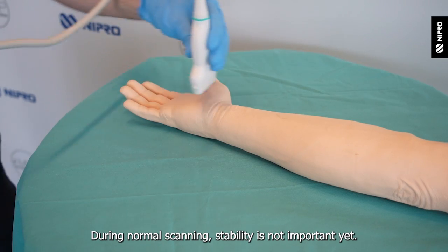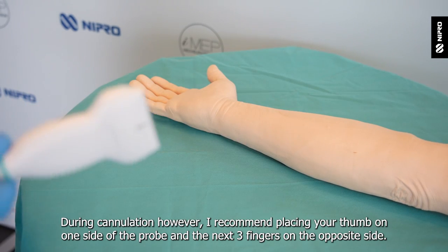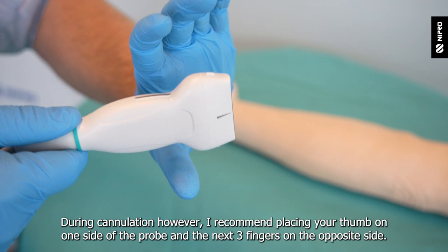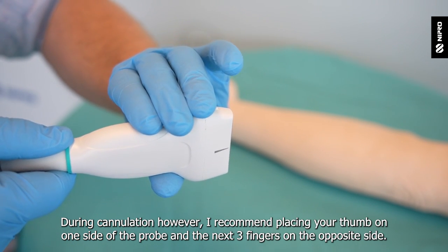During normal scanning, stability is not important yet. During cannulation, however, I recommend placing your thumb on one side of the probe and the next three fingers on the opposite side.